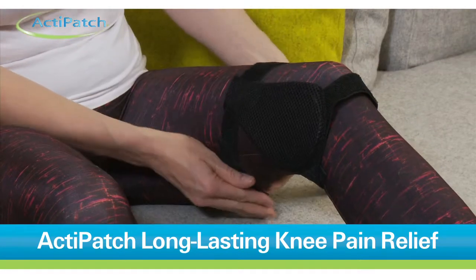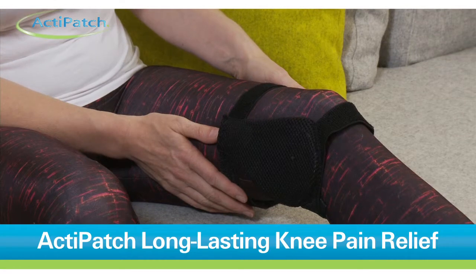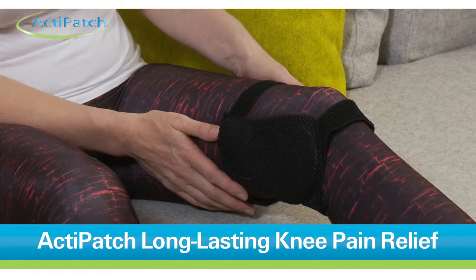Unlike a TENS machine, you will not feel heat or vibration. In fact, ActiPatch is completely sensation free. So the only thing you're going to feel is better.